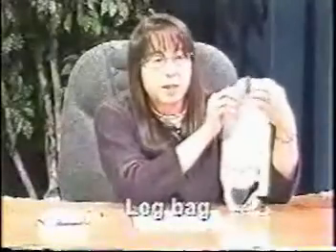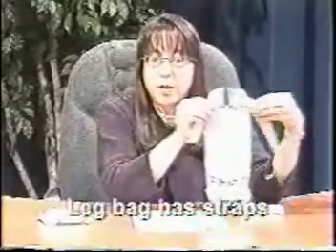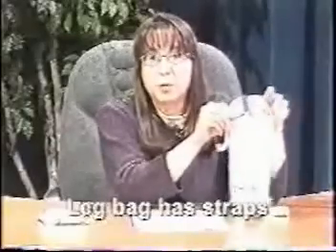This is the top of it. It will say top on the bag, and it has a drainage spout. It is applied to the thigh, and it has straps that you can wrap around the thigh.